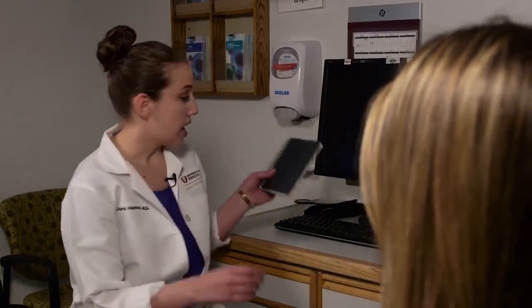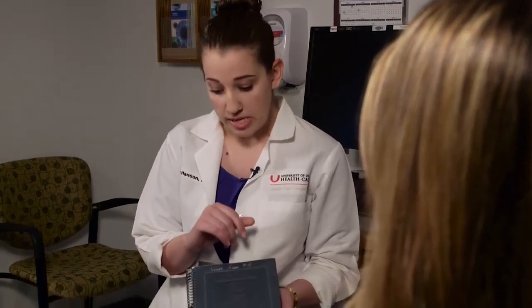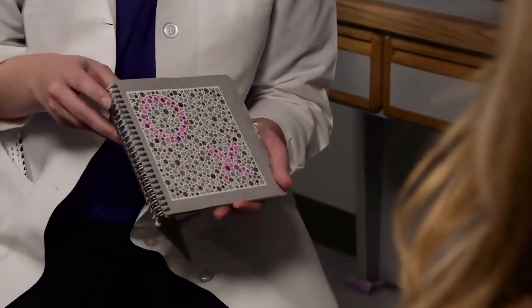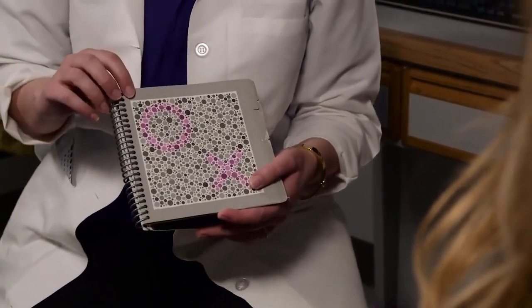We're going to start today with the Hardy-Rand-Rittler pseudo-isochromatic color plates. This is one way that you can test color vision. The nice thing about these plates is that they can screen for red-green defects and for blue-yellow defects. The Ishihara color plates primarily just screen for red-green defects. So generally, you want to examine patients who have an acuity of around 20/200 or so.